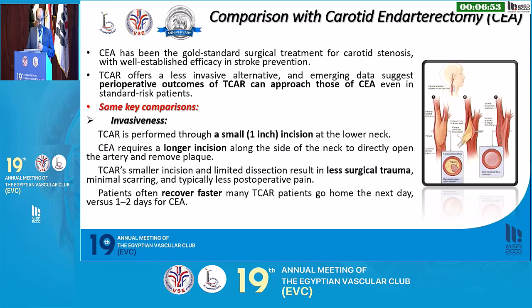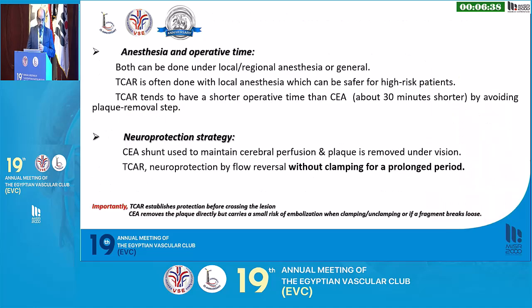at the root of the neck, instead of the long incision of carotid endarterectomy, with less surgical trauma. The patient recovers faster with the TCAR and goes home the next day, versus 1 or 2 days after carotid endarterectomy. About the anesthesia, both can be done under local or general anesthesia according to the patient's condition, but the TCAR tends to have a shorter operative time than carotid endarterectomy by about 30 minutes.